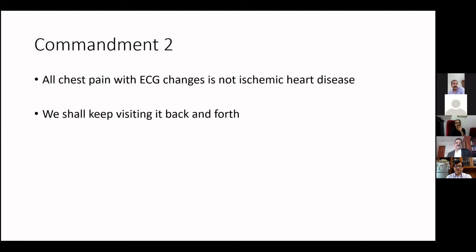So this takes me to the next, though not very appropriate, commandment for my talk. All chest pain with ECG changes is not ischemic heart disease, and caveats are many. We shall keep visiting it back and forth again.